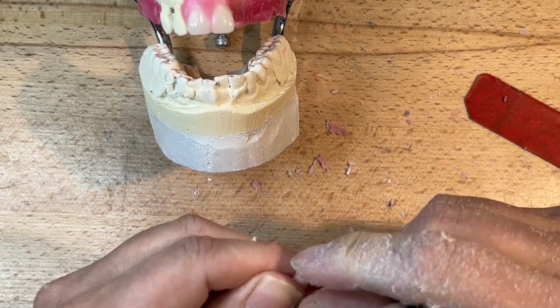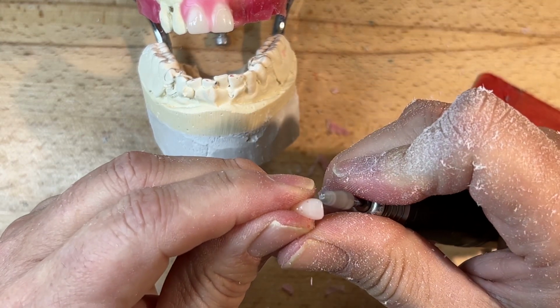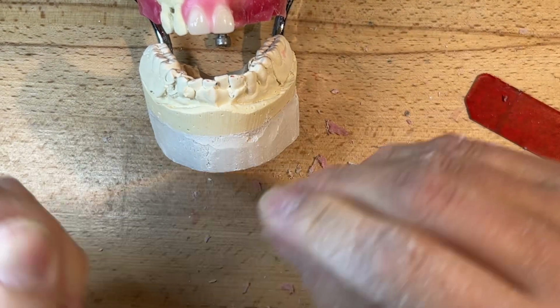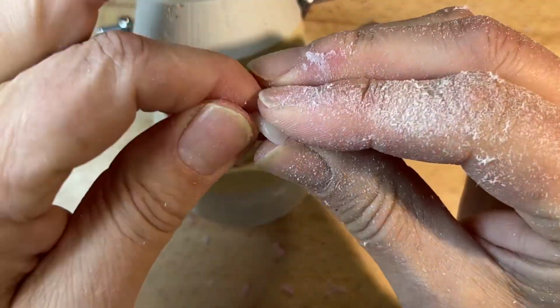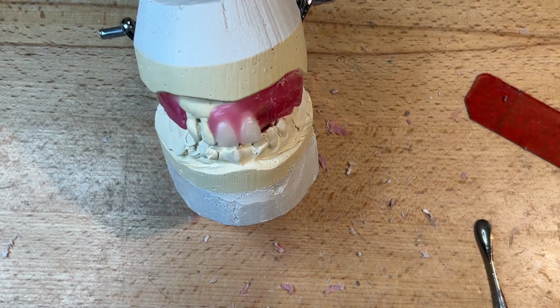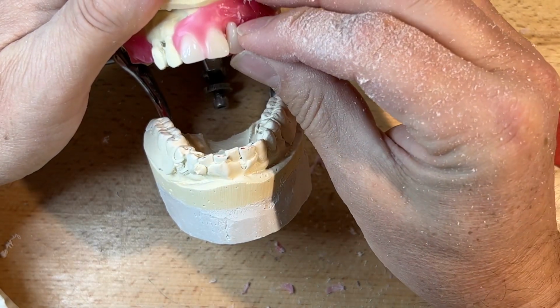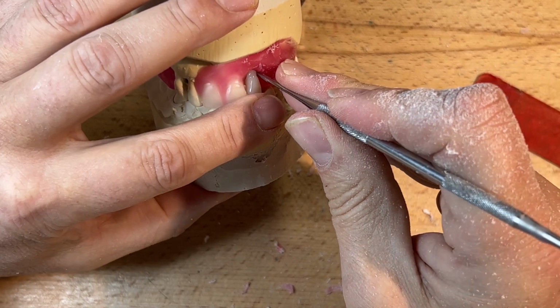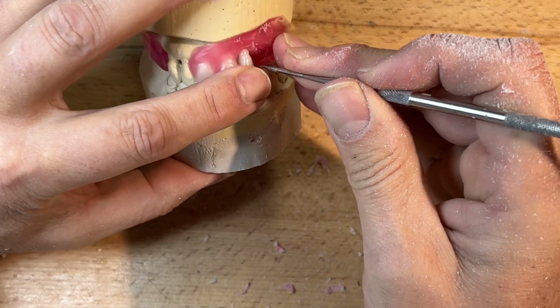Asymmetry, but I may just match it a little bit, and I'll take the distal incisal edge off. It's already a tapering ovoid mold, but I'm just going to increase that a bit more. Maybe obviously a little bit more feminine too. I may tuck it in slightly behind the central.